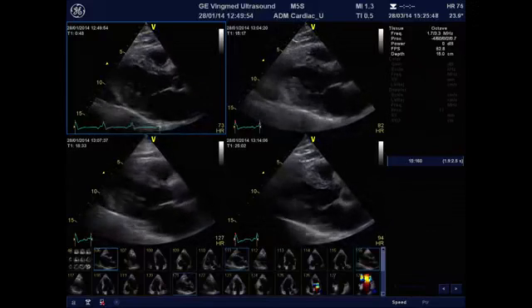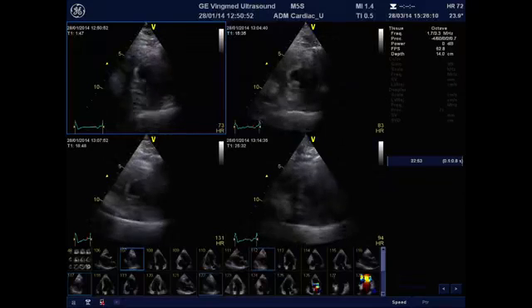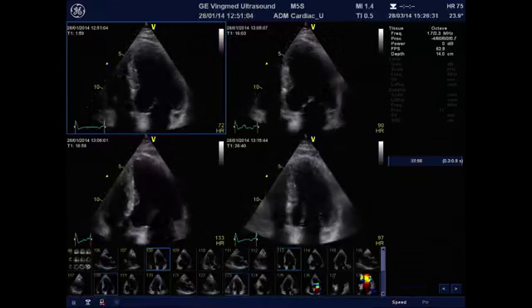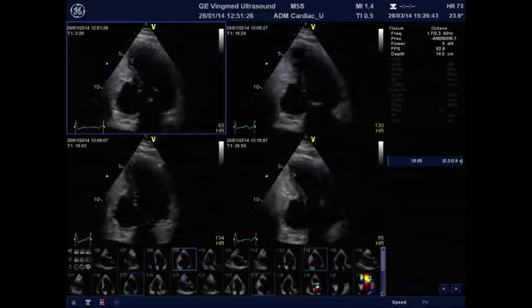whether there is possible myocardial ischemia. So this is the result of his exercise test. You see the parasternal long axis view at rest, at low level of exercise, peak exercise and recovery. And on this view there is no evidence of ischemia. We show now the short axis view, again at the level of the papillary muscle. There is no evidence of ischemia. This is the apical four-chamber view with clearly no evidence again of myocardial ischemia. And of course, no functional recovery of the inferior wall. This is not really surprising, and no evidence of myocardial ischemia.